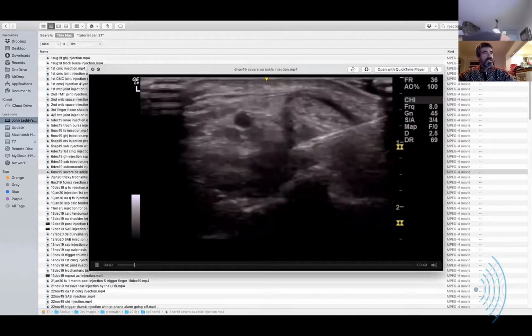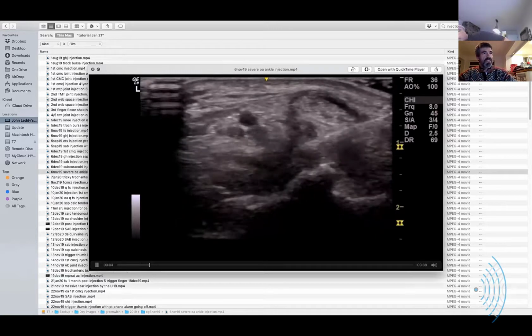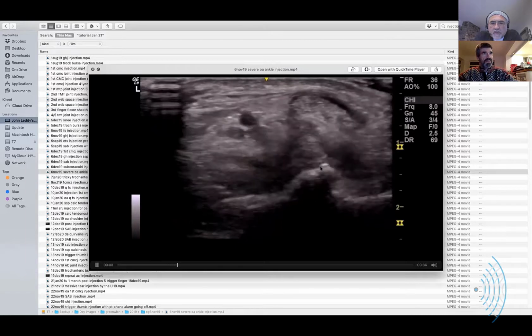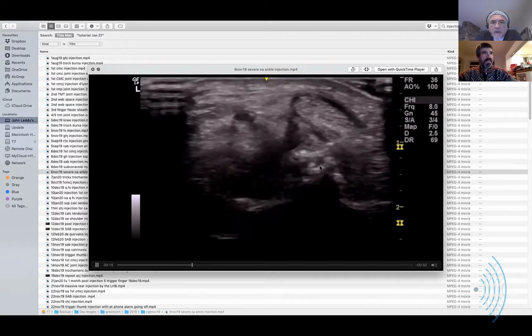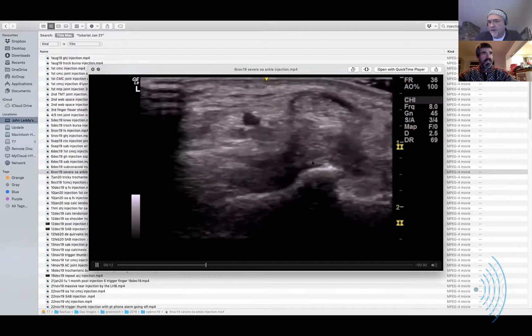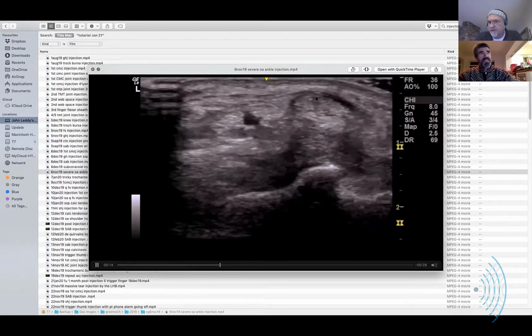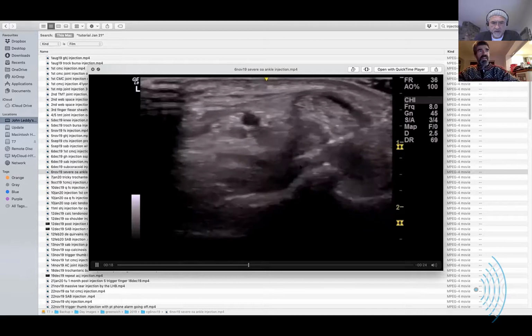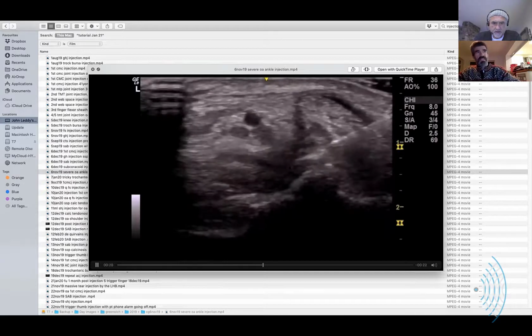So, ankle joints are a bit tricky. You often have to go over these osteophytes. So here I am coming in. What tendon is that? The peroneal tendons, or is that the posterior tib? This is probably tibialis anterior. Okay. And so I've decided this is a particularly tricky ankle joint.